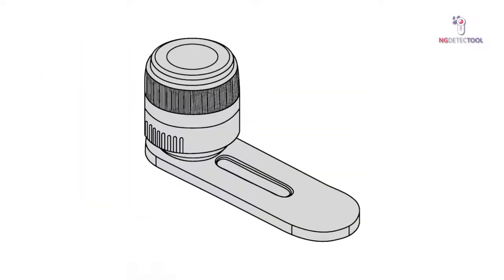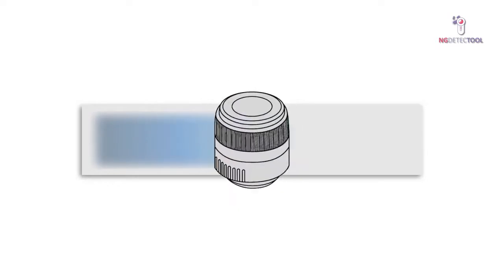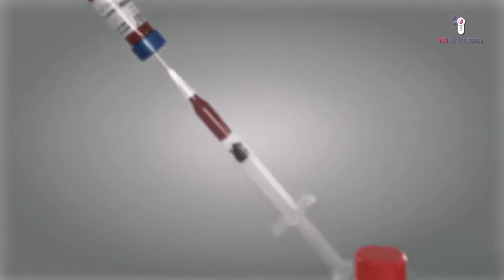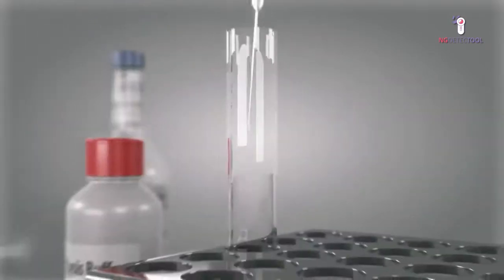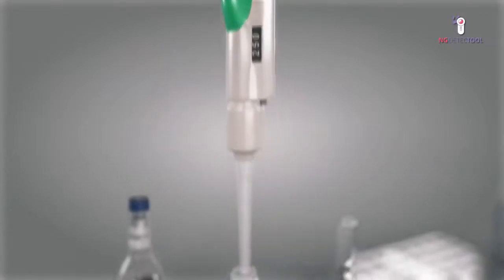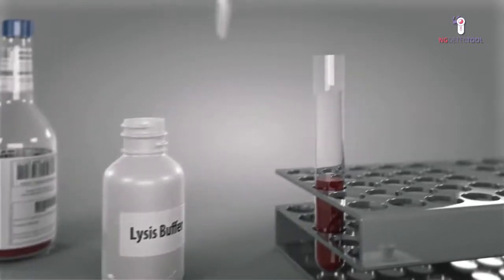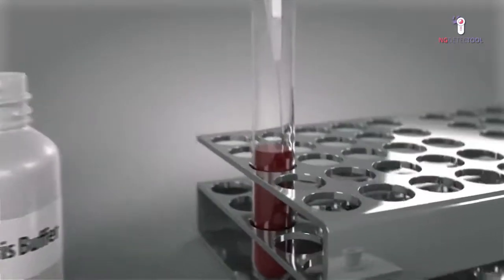The AMR DetecTool corresponds to a strip enclosed in a plastic device, in which sample treatment is carried out in a very simple way. The functions include a sample processing step and the immunological reaction that takes place on the strip. When working with a positive blood culture, the first step consists in mixing 500 microliters of the sample with 250 microliters of the lysis buffer and let react for a minimum of 2 minutes and a maximum of 30 minutes.